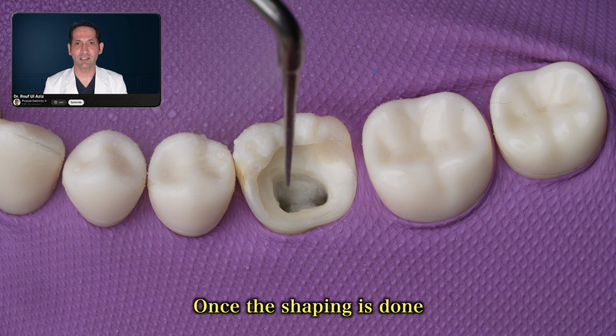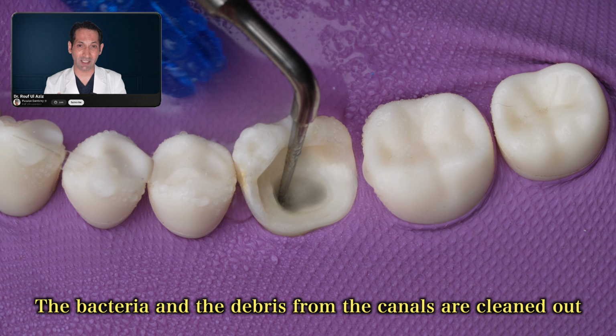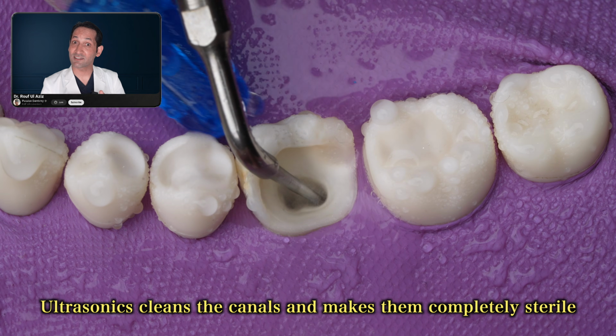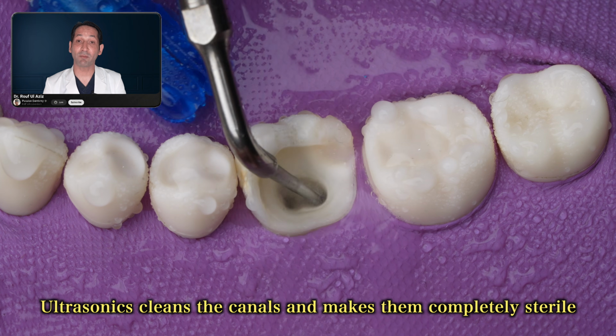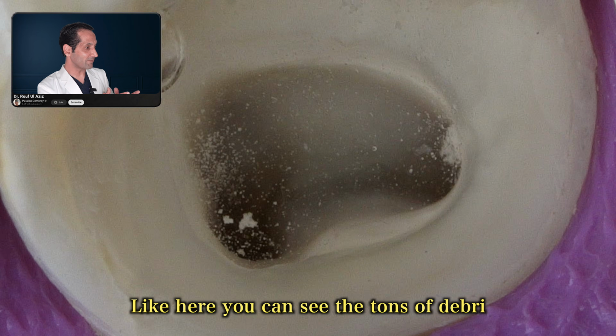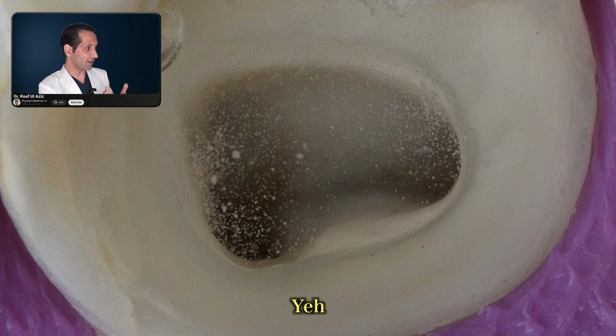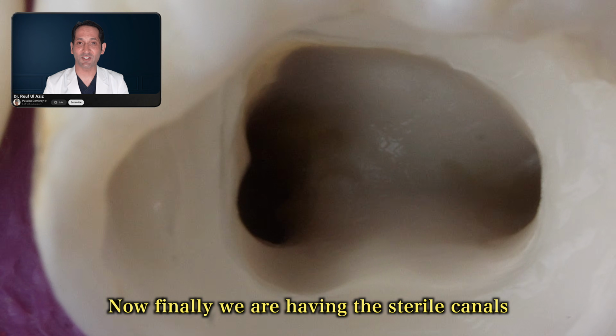Once the shaping is done, the bacteria and the debris from the canals are cleaned out using ultrasonics. Ultrasonics cleans the canals and makes them completely sterile. Like here, you can see tons of debris being forced out of the canals. Yeah. Now finally we have the sterile canals.